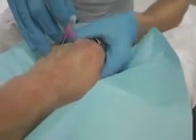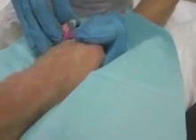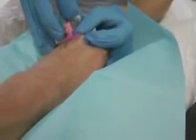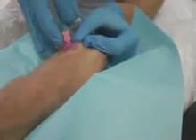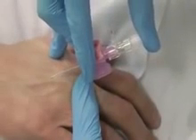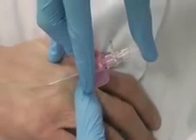Keep the skin tight to anchor the vein. Gently advance the cannula. Warn the patient of a sharp scratch on insertion.